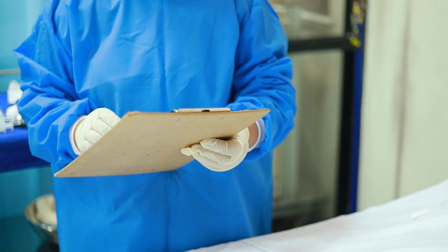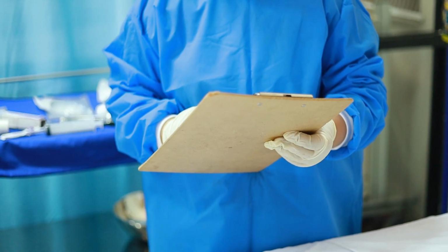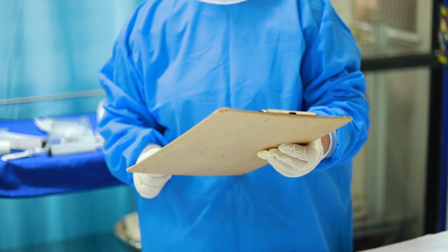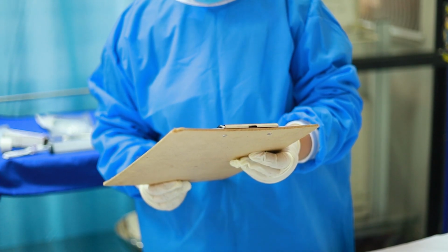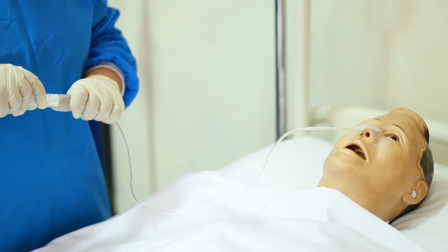Document the reason for the tube insertion. Please note down the type and size of the tube, the nature and amount of aspirate, the type of suction and pressure setting, the nature and amount of drainage, and the effectiveness of the intervention. Removal of nasogastric tube: flush with 20 ml water or normal saline.